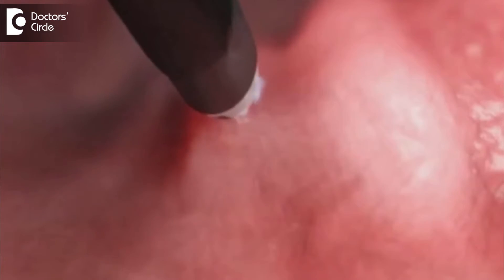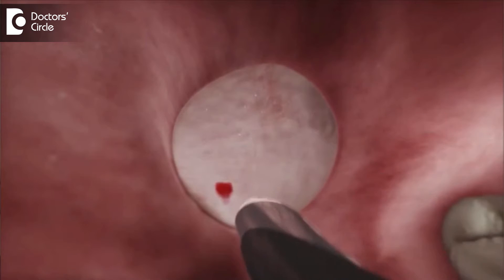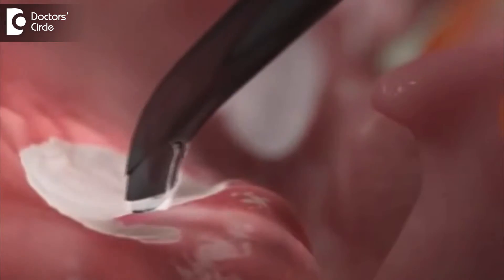A nasal endoscope — 0 degree or 30 degree — is inserted through the nose to visualize the adenoid, and the coblator wand is used to remove the adenoid layer by layer in a sweeping motion. At the same time, if there are any small microscopic bleeds seen, they are coagulated with the coagulate mode. After all the adenoid tissue is removed and the perimycium is visible, we ensure complete hemostasis — that there is no bleeding at all even at a microscopic level — and then the surgery is stopped.